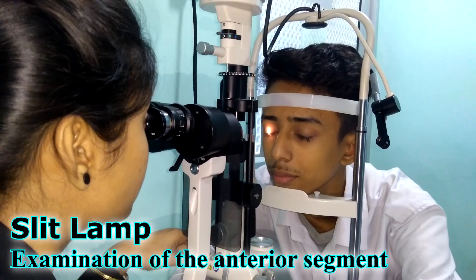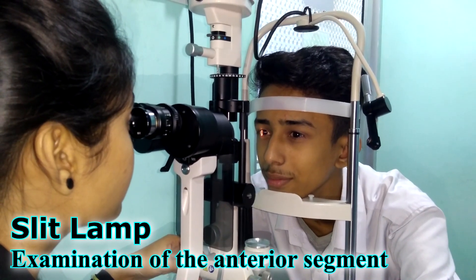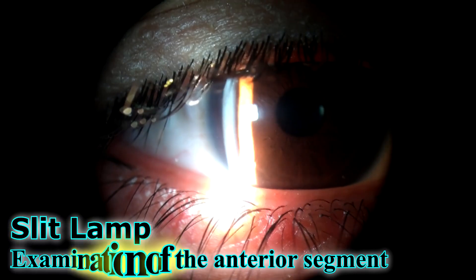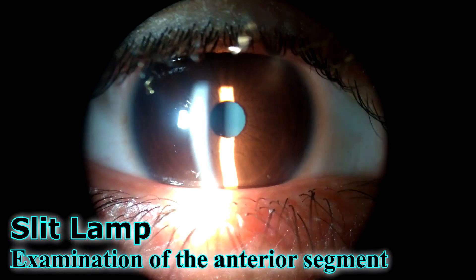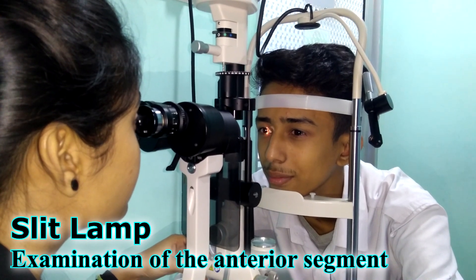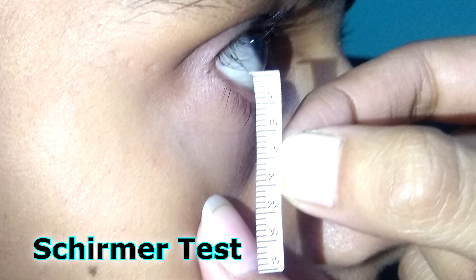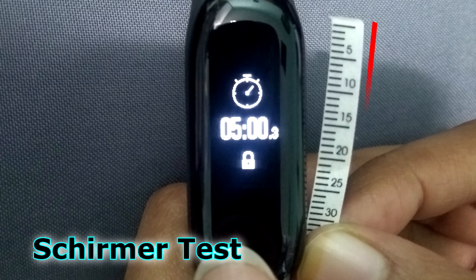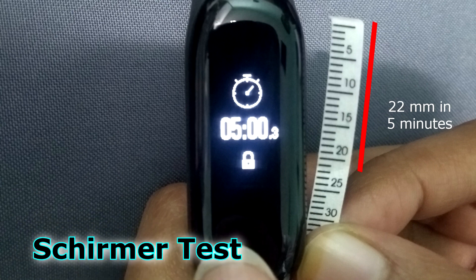Next we are going for preliminary examination and measurement. After determining the power, we must do a complete preliminary evaluation of the eye. Under it, we should perform slit lamp examination to assess the eyelid, eyelashes, conjunctiva, cornea, anterior chamber, iris, and crystalline lens. We must also do a dry eye evaluation, because fitting contact lenses in excessive dryness may be risky. In this video we are performing Schirmer's test for five minutes and got about 22 mm.